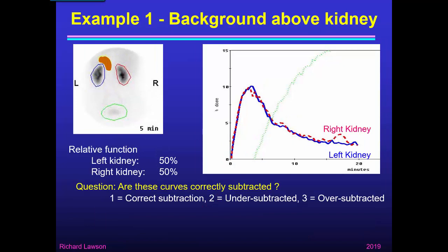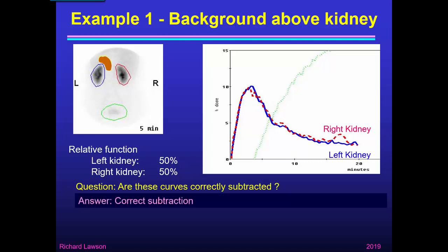Here I've taken a different background region above the kidney and applied it to both renogram curves. The relative function still comes out at 50%. I think that they're correctly subtracted — both curves do start properly from zero, so the correct amount of blood background has been subtracted.